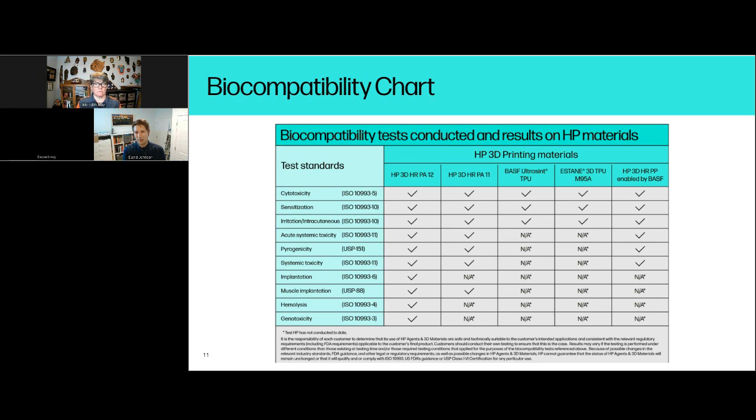useful but also cautious on, as a company that says we need these test standards to be approved, but we haven't actually done any testing yet? So you do have the opportunity to leverage master files that are registered with the FDA. A master file, for example, will have all of this actual testing that's been done. And so if the master file covers the processes up to this point, you really only have to evaluate the processes that come after that point.